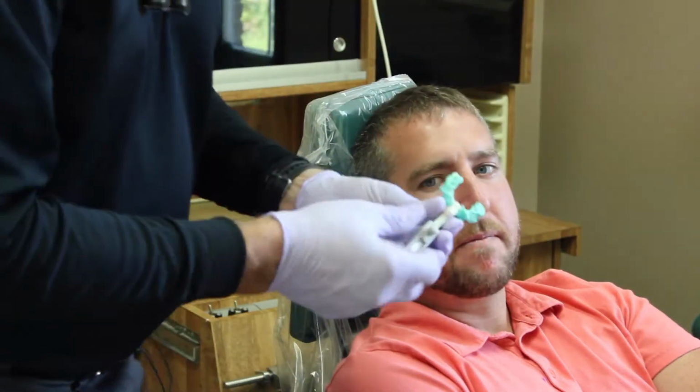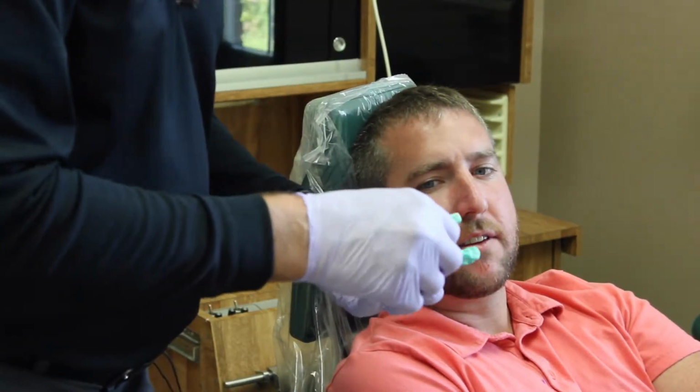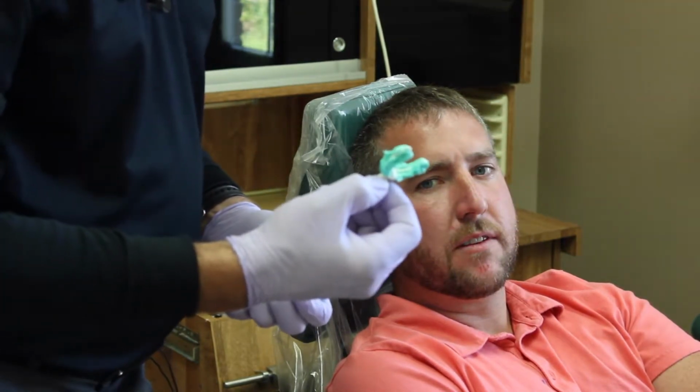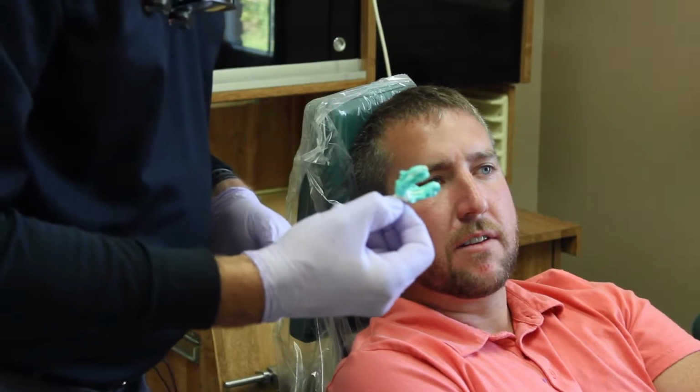Beautiful. And now what I do is I simply loosen this screw and I send in this bite fork with the bite material on it to allow the lab to mount the models.